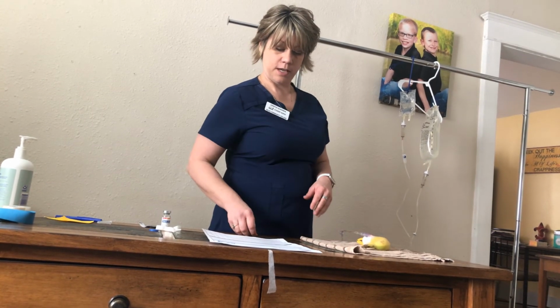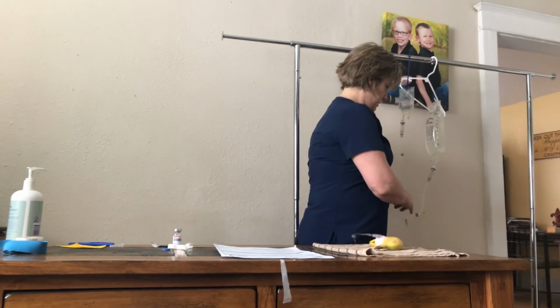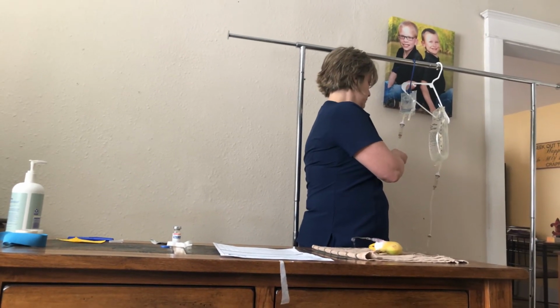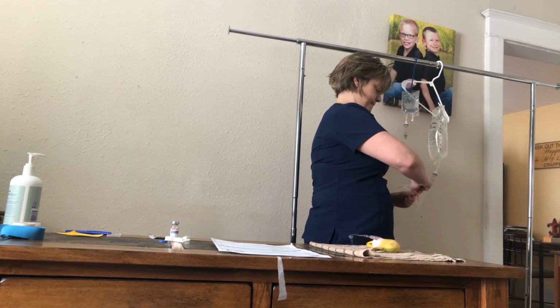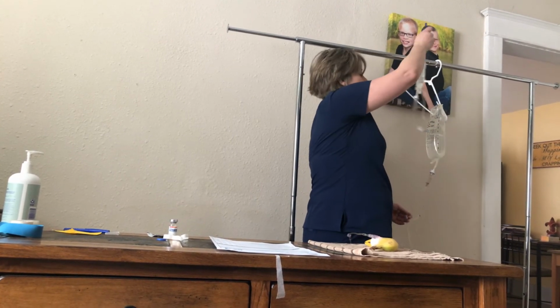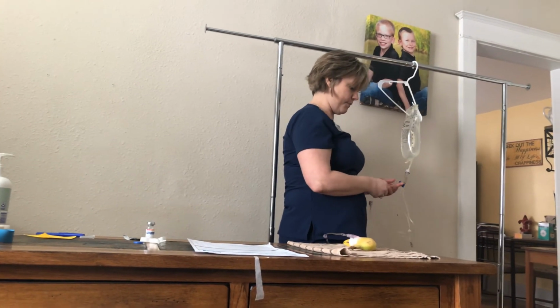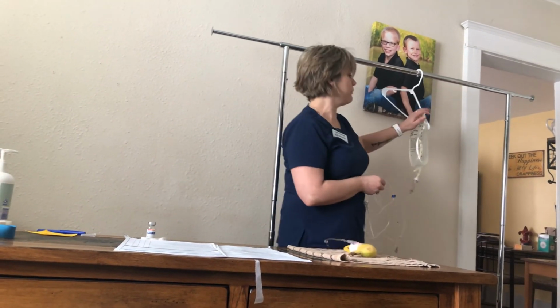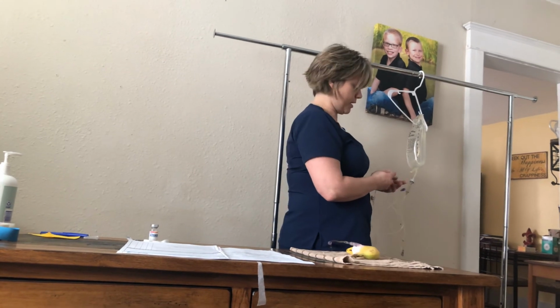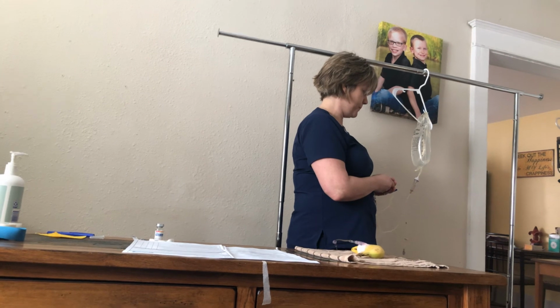Okay. After my piggyback is done, I'm going to go ahead and clamp this off. Take the tubing off. We're going to dispose of all of that. We're going to open this back up, and we need to return this to its original height if we would have moved it. And then we're going to adjust this back to 28 drops per minute, where we had left it at.